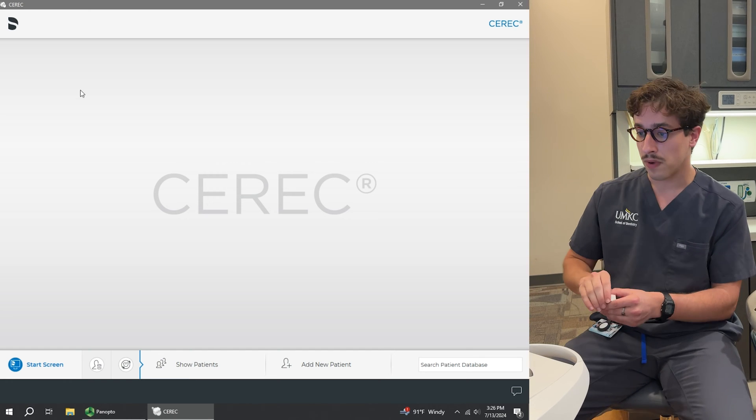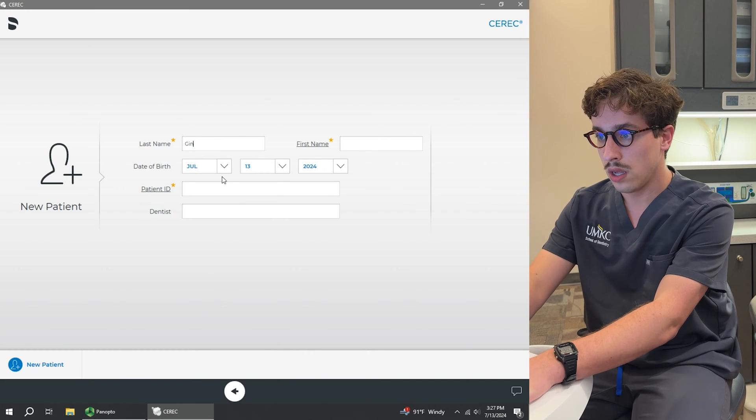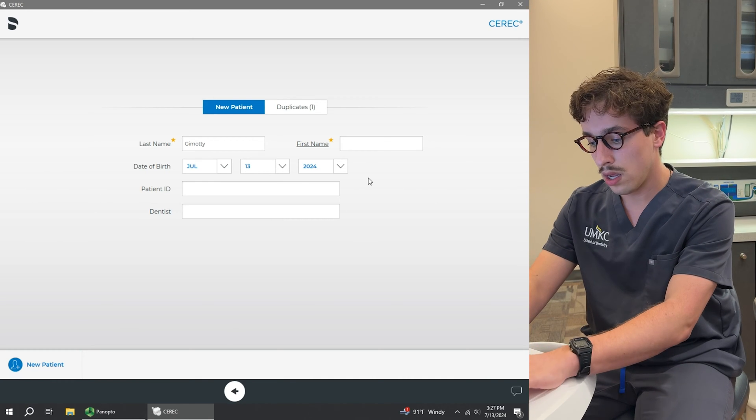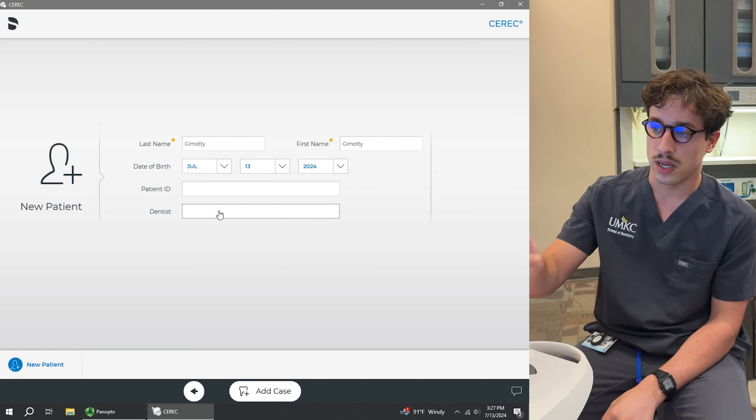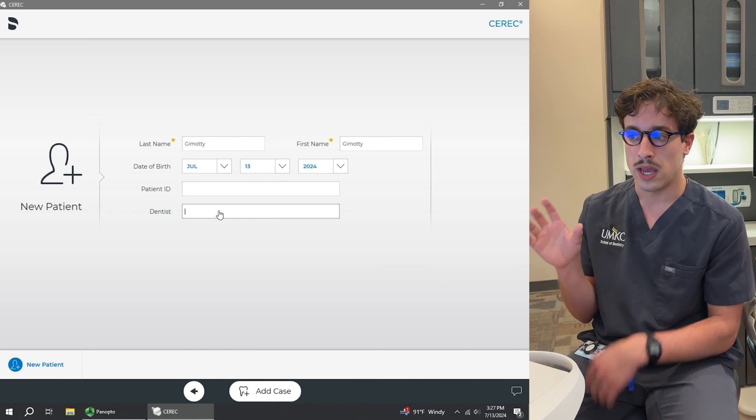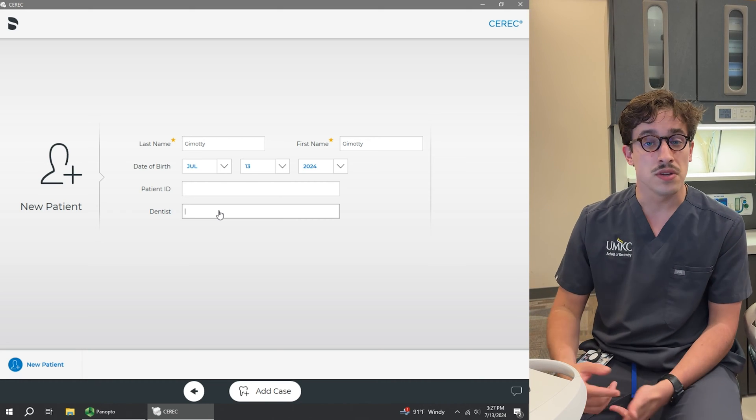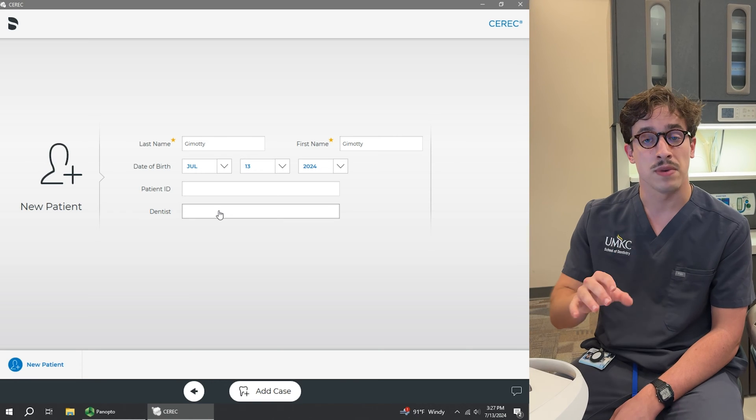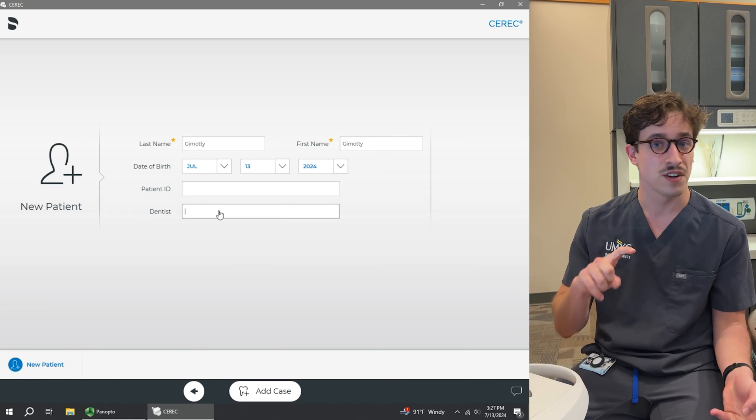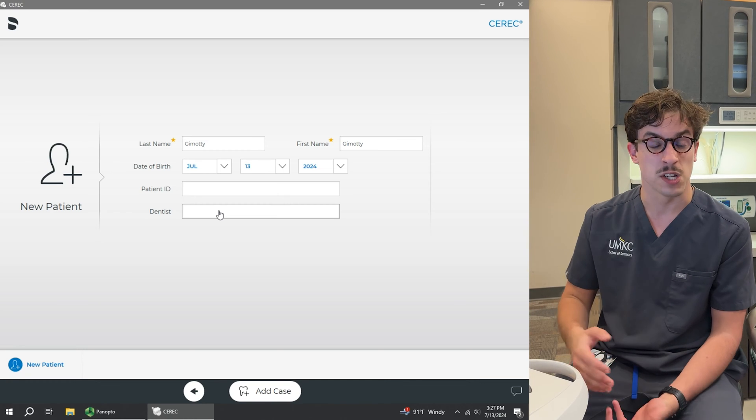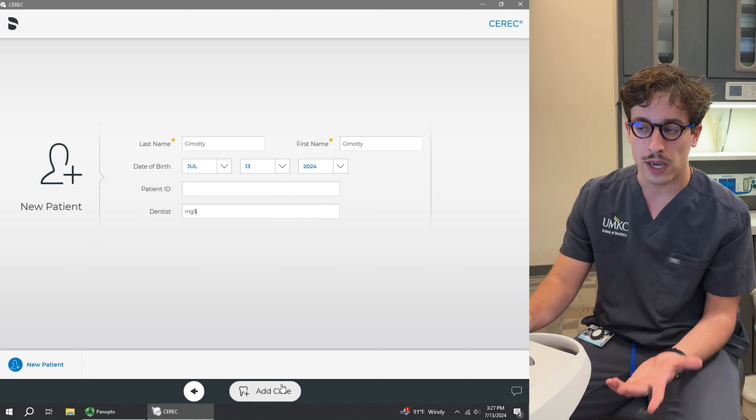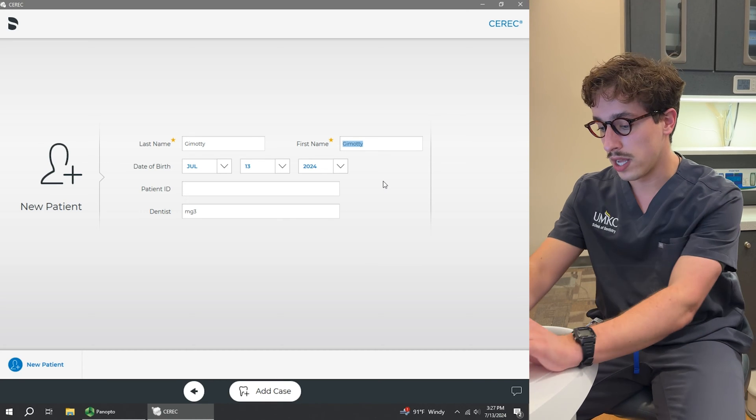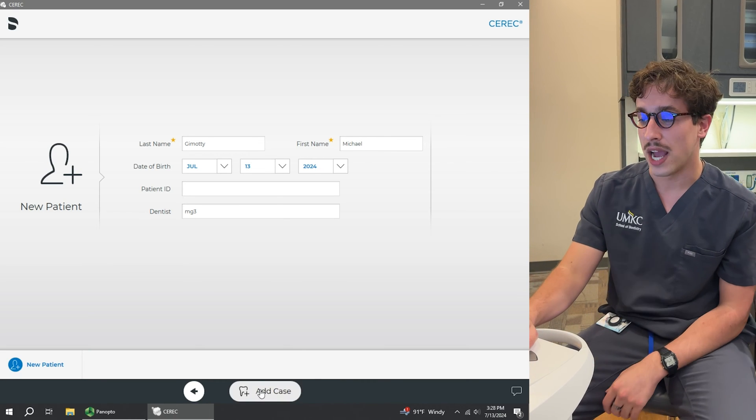So now that it's up and running right over here, we're going to go ahead and add a new patient. We're going to click Add Case. One of the things to note is that you can add yourself as the dentist. When adding yourself as a dentist, it will categorize the cases and sort them by the dentist. So if you're using the same machine multiple times, because these files are not shared from machine to machine, you need to make sure that you're writing your name down in the exact same way. So if the capitalization is different, if the period is different, if the space is different, it will all be categorized under a different name within this and makes the data management a little bit more difficult. So I always just do my initials in lowercase, just for continuity's sake. And you can add the patient ID or date of birth if you would like. And then we're just going to click Add Case down here at the bottom.